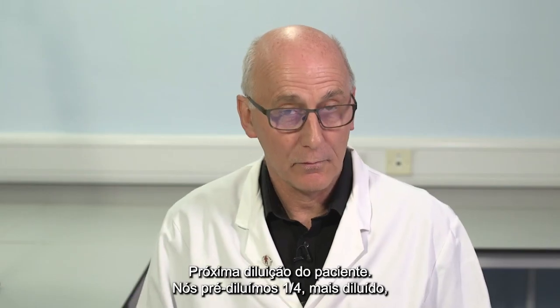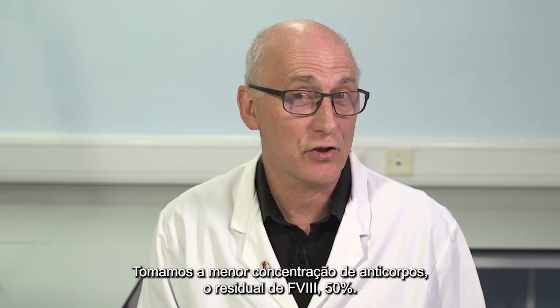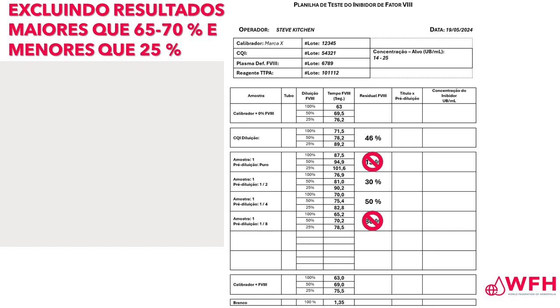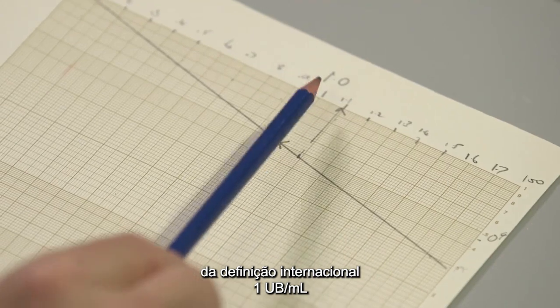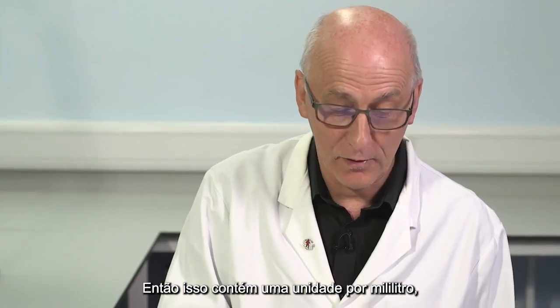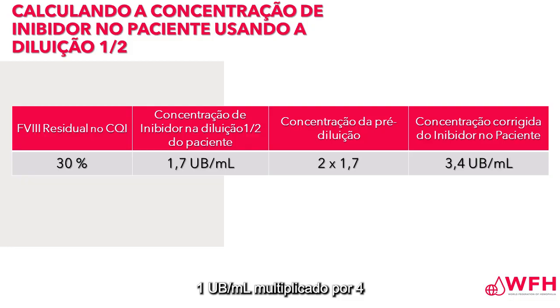Next patient dilution. We pre-diluted 1 in 4, more dilute. We've taken the antibody concentration lower. The residual factor VIII, 50%. I don't need the graph. 50% from the international definition, 1 unit per mil. So that contains 1 Bethesda unit per mil, multiplied by 4 for dilution, 4.0.